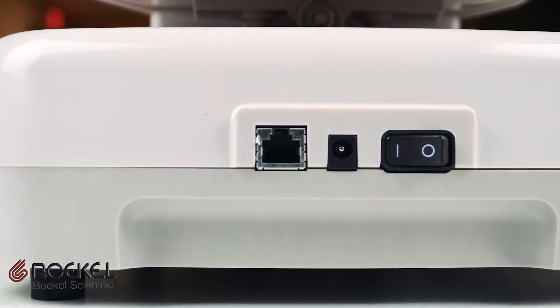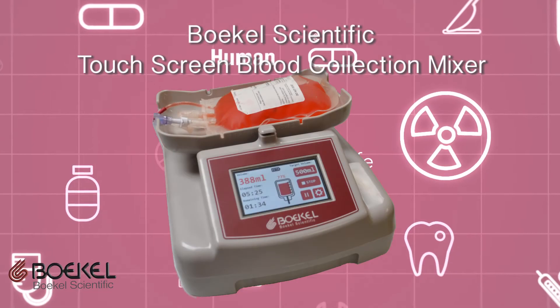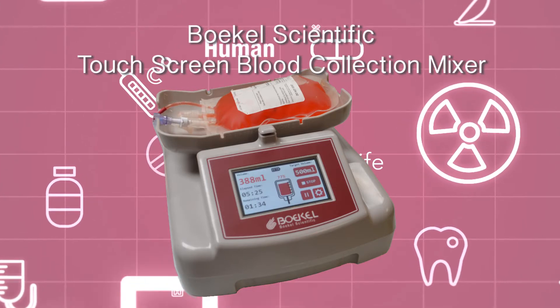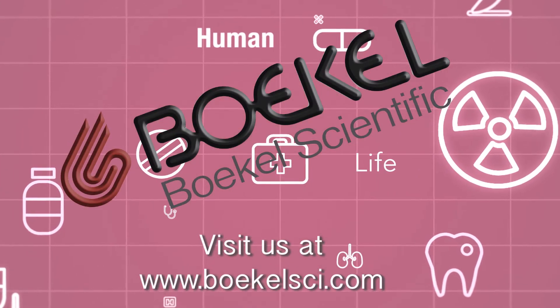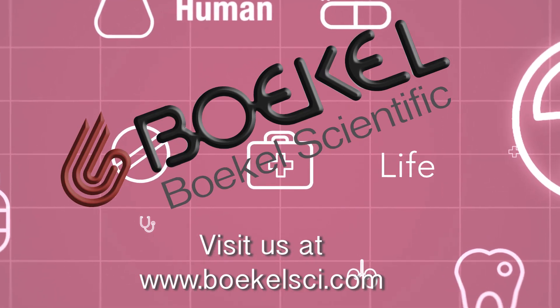The ethernet port is located directly next to the power port and the power switch. For more information on this fantastic product and its many wonderful capabilities, visit the website for Boekel Scientific at www.boekelsci.com.